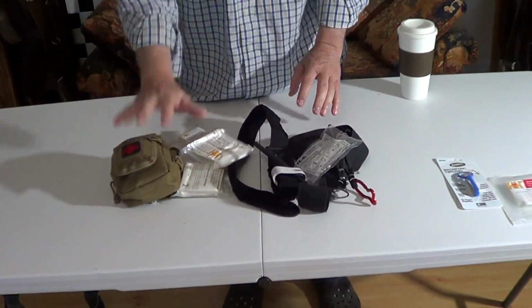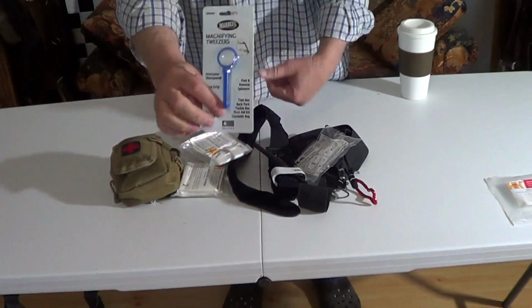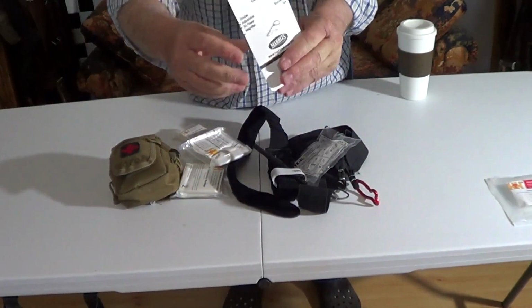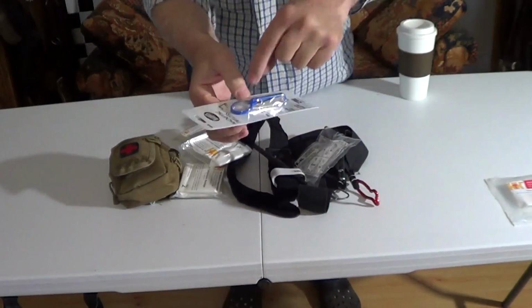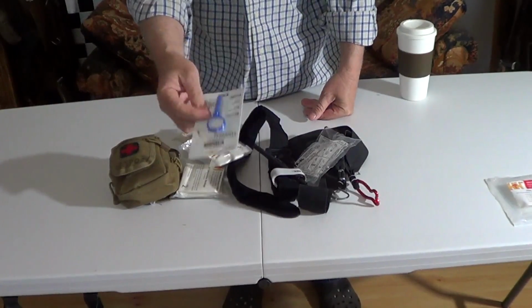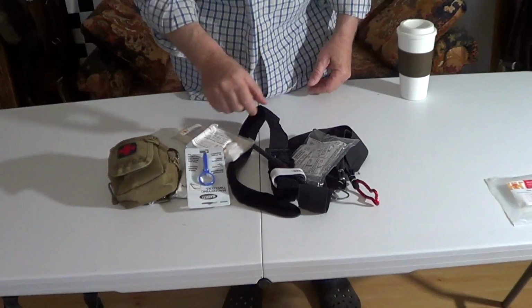So that's that. Also, for the tweezers, I went ahead and ordered some. I like the tweezers with a magnifying glass already connected, and that way, when you're digging for something, it makes it a lot easier to find. This is a good magnifying glass. So I picked up a couple of those, and I'm going to take the tweezers I got out of here and put these in here.